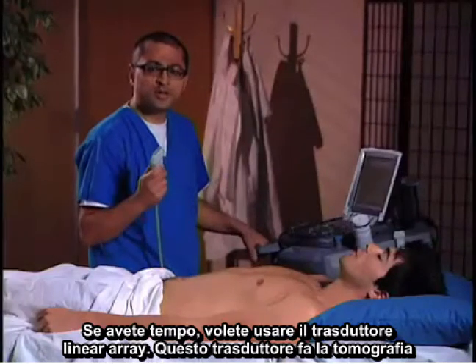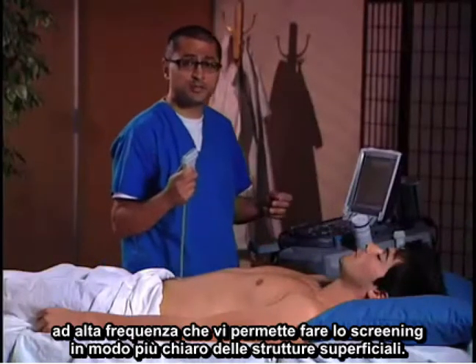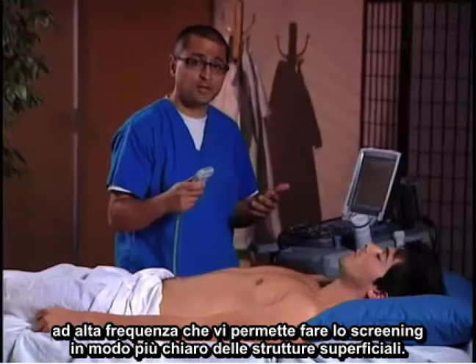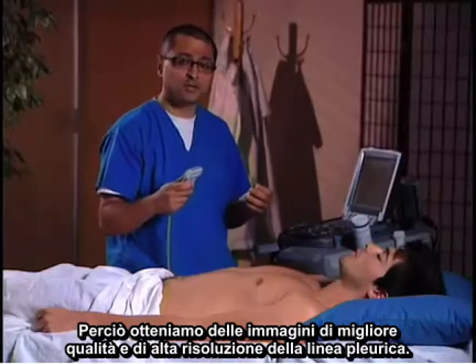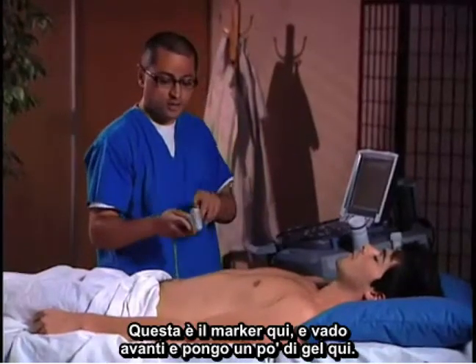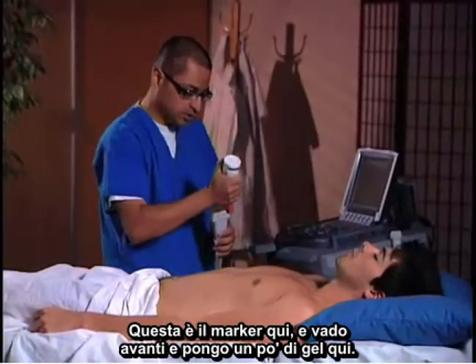If you have time, you want to use your linear array transducer. This transducer does high frequency imaging and allows you to do much better imaging of superficial structures, so we're going to get a lot better quality, high resolution pictures of the pleural line. Here are the transducers I've chosen — this is the marker — and I'm going to go ahead and put a little gel here.